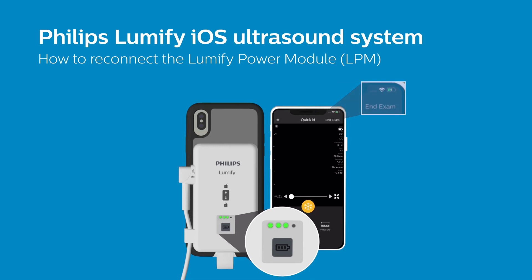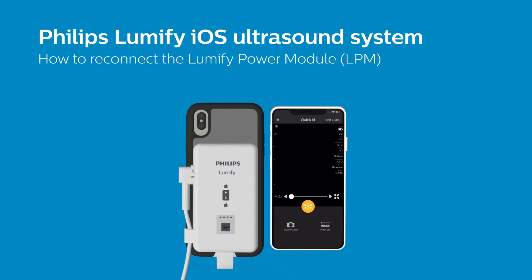After a few seconds, you should notice the LPM battery icon appears in the top right corner of the Lumify app. Now you can hit the Unfreeze button and resume scanning.